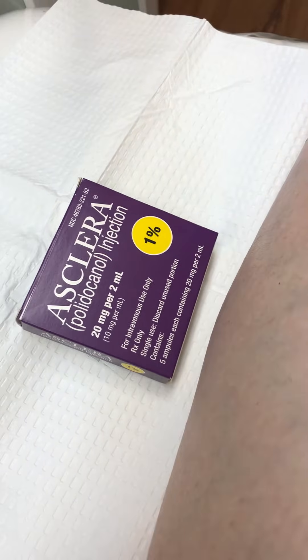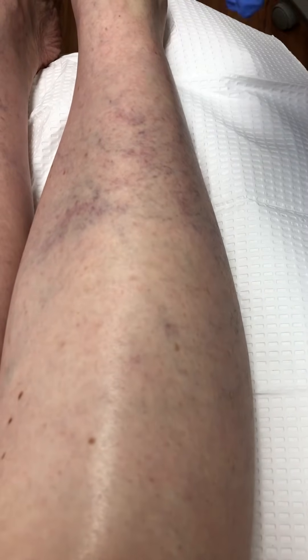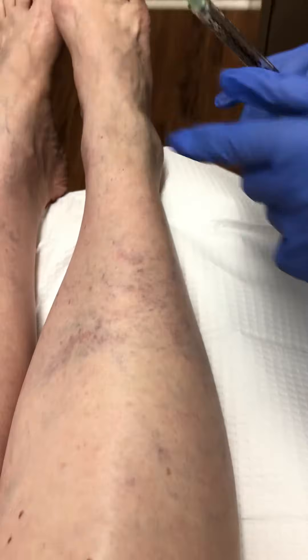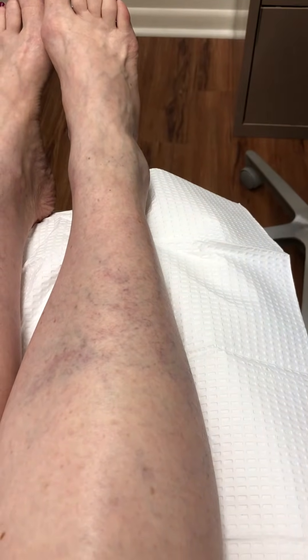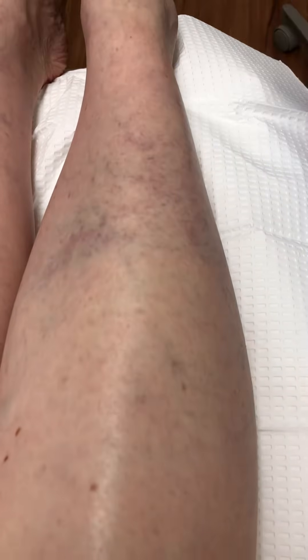Today I'm going to demonstrate sclerotherapy using Asclera, which is polidocanol. It's my favorite sclerosing agent. I diluted the product, which is 1%, with normal saline to bring it down to 0.5% for these smaller reticular and spider veins.